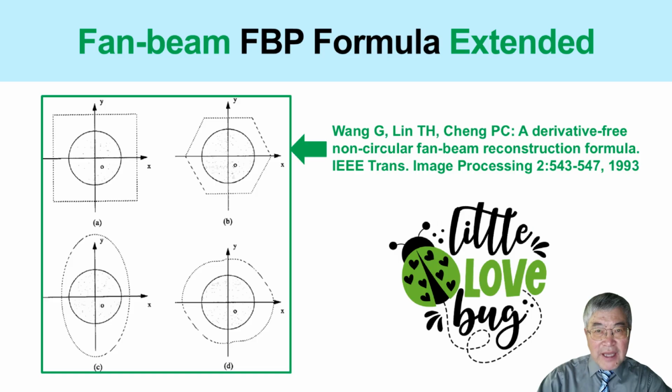So do we really need the radius to be constant for the entire scan? From this heuristic point of view, not necessarily. Even if R changes with the fan beam angle, the same type of formula should still work reasonably well, as long as we use the correct local geometry at each view. This was the idea behind one of my early papers from my PhD research published in 1993. I called it a derivative-free, non-circular fan beam reconstruction formula.